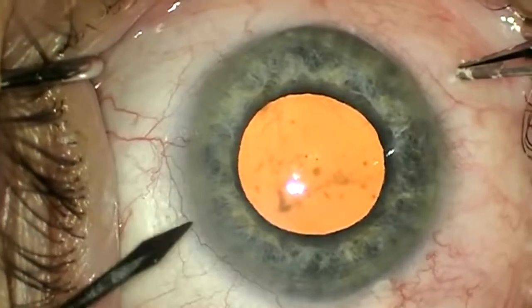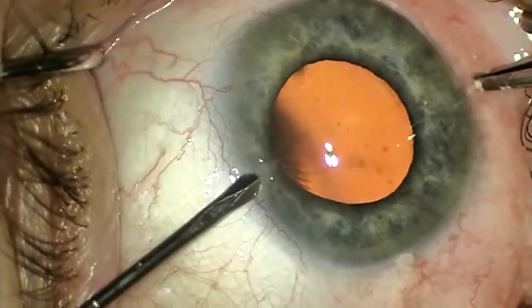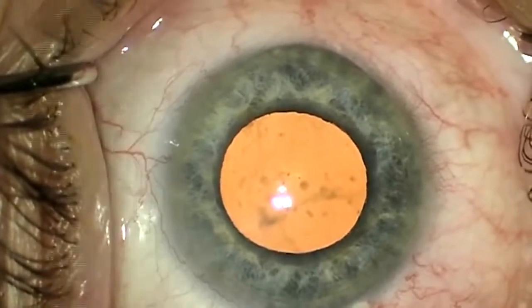We've all been plagued with the scourge of intraoperative floppy iris syndrome. There have been several options to deal with this problem ranging from viscodilation, pharmacologic dilation, and mechanical dilation.